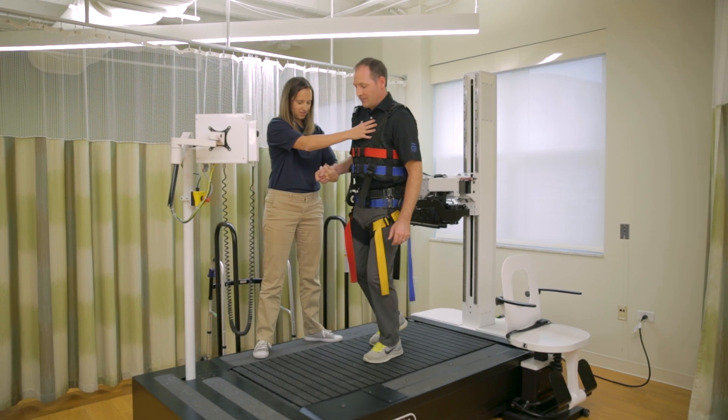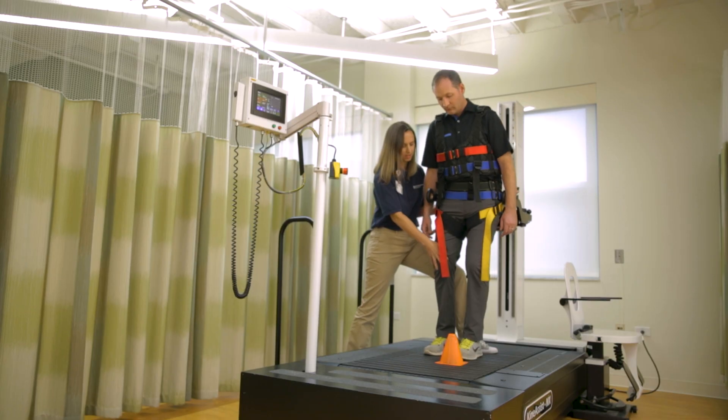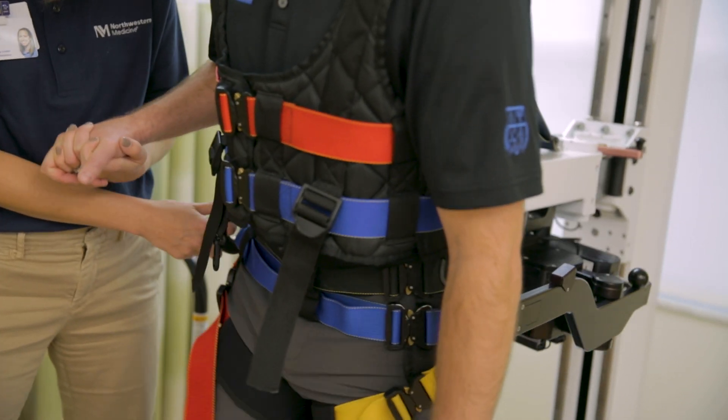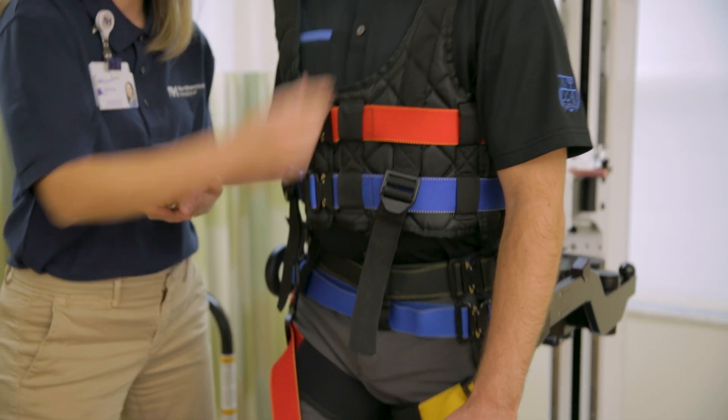The KineAssist MX is a device for practicing walking and balance-related exercises that can result in improved performance of daily activities. You are placed on the KineAssist MX platform and supported by a pelvic harness system that acts to catch you should you lose your balance.